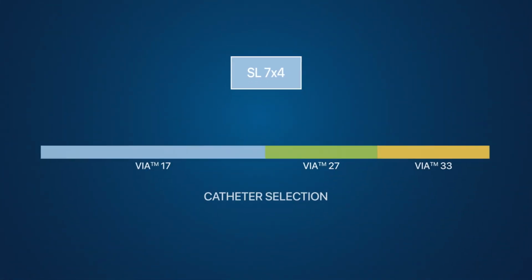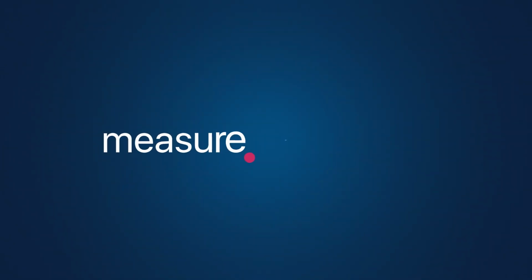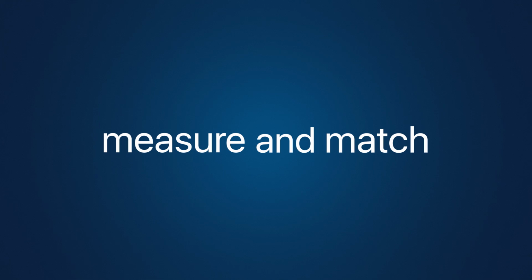The correct microcatheter is also shown in the table. Remember, measure and match. 2 simple steps to a single device solution.